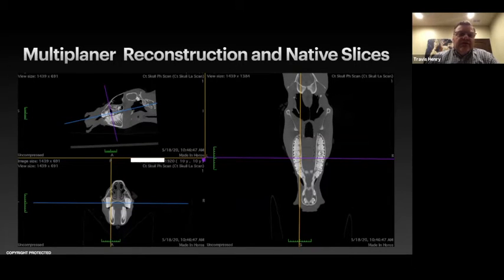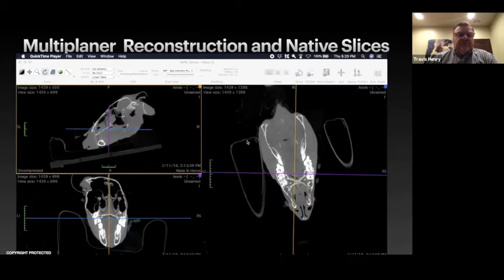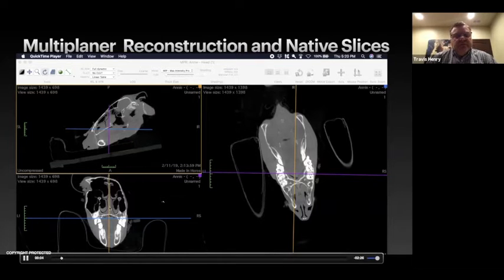We've lined this up to be perpendicular so that the dorsal view is right in the same parallel plane as the palate, and then we're perpendicular to the palate so that we can look at the individual teeth nicely without getting part of one tooth and part of another tooth in the same transverse slice. So this is just a little video of that happening. And you can see as my mouse moves around, this was a video that I made as I corrected that and came up with the image that we saw before.